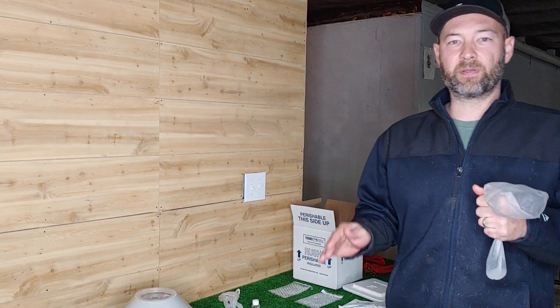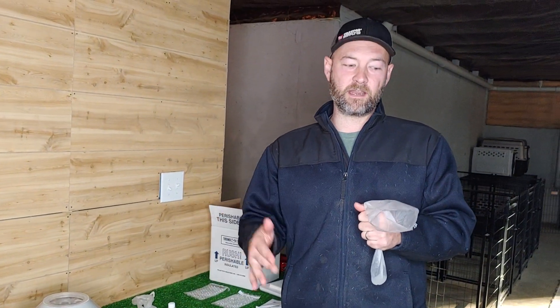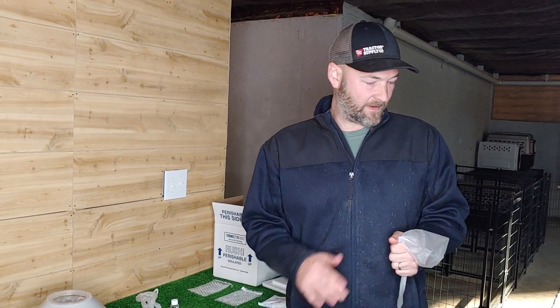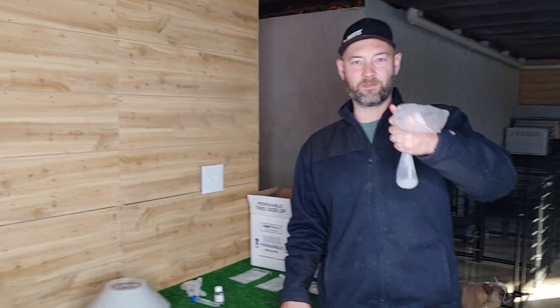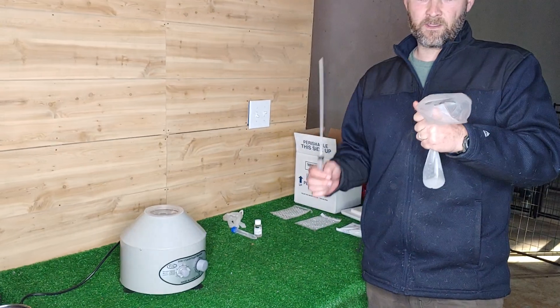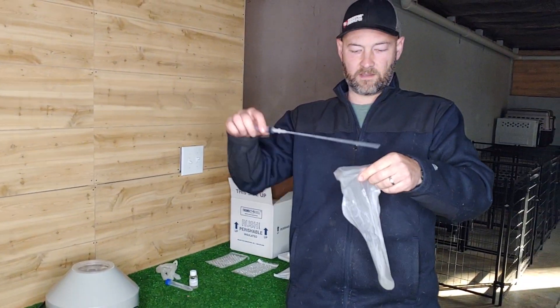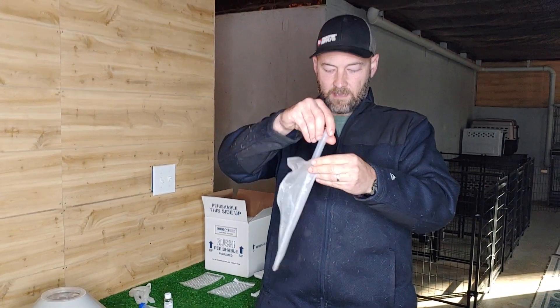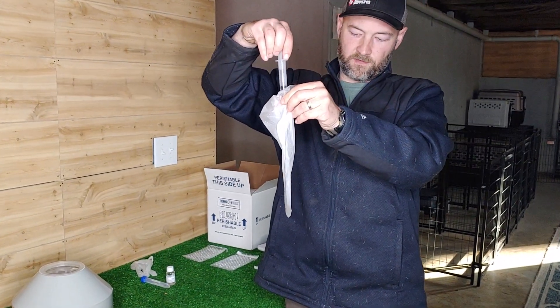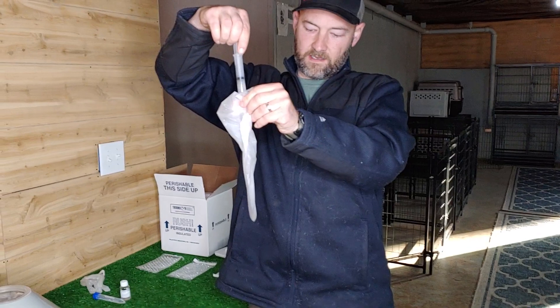We're going to show how we prepare our dog semen for our in-house artificial inseminations, or how we prepare it, package it, and ship it out to customers who use our studs. I spared you the details on collecting from Legend. Here's the dog semen — we collected from Legend. So the first thing we're going to do is collect the semen and then, using a basic AI pipette and oral syringe, we're going to suck it in.